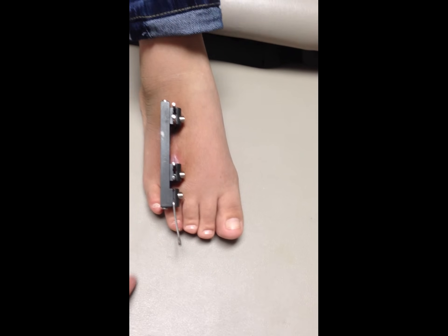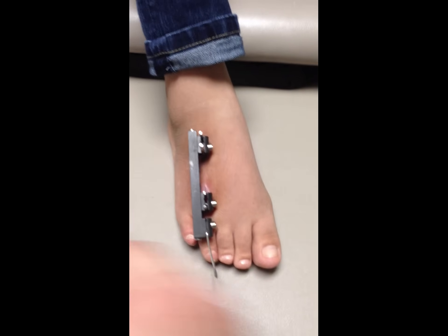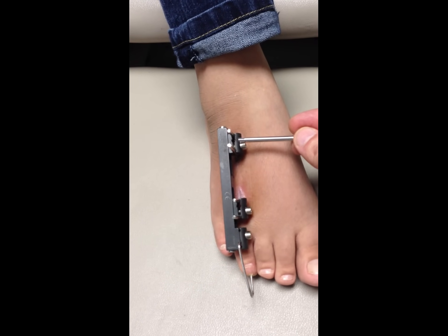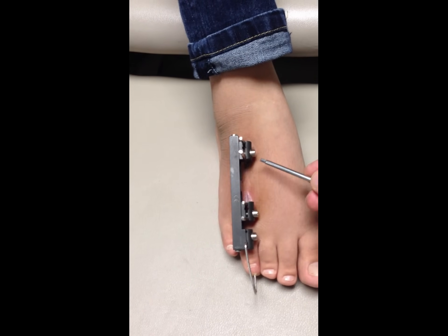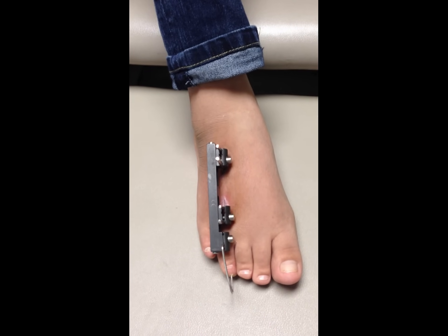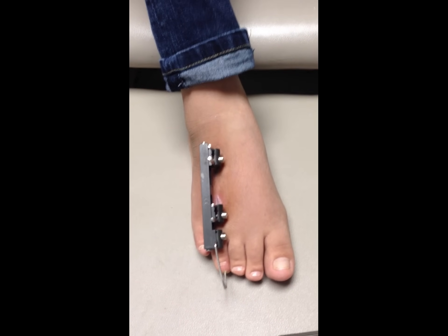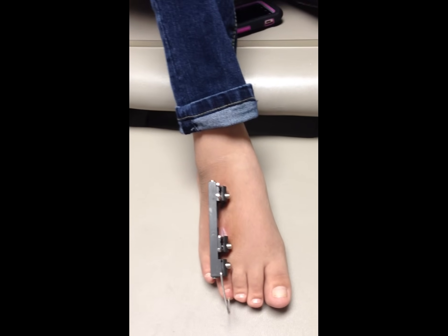Today we're going to dynamize the device. The way I usually dynamize this device is to loosen this screw and that screw, then jiggle the device a little bit, and then tighten it back up. What that does is take the load off the device and put it on the bone. Bones respond to increased pressure, so we want to make the bone more solid and stronger — this process is called dynamization. I'm going to demonstrate that and hand the video to Mayra so she can videotape me.